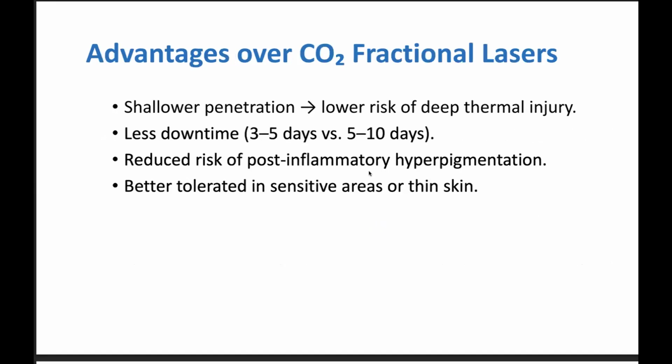The advantages of the Erbium laser compared to CO2 fractional lasers: the Erbium laser has lower, shallower penetration, so it reduces the risk of deep thermal injury and has less downtime. It reduces the risk of post-inflammatory hyperpigmentation. It is better tolerated in sensitive areas or thin skin. Next.